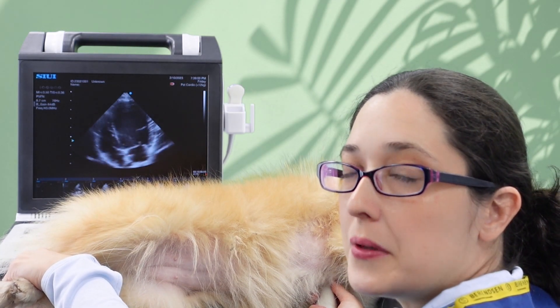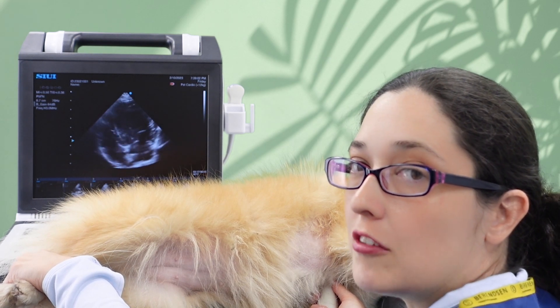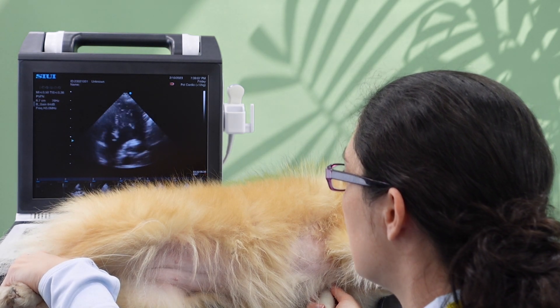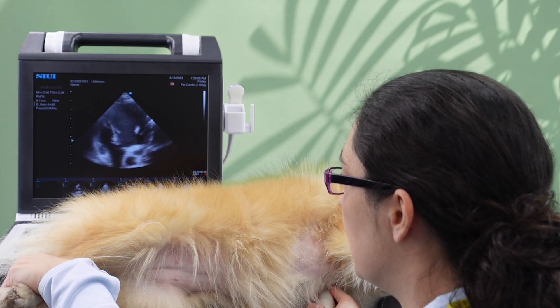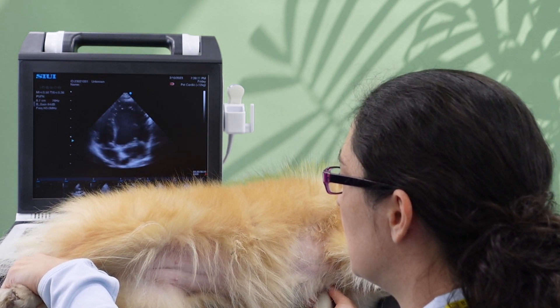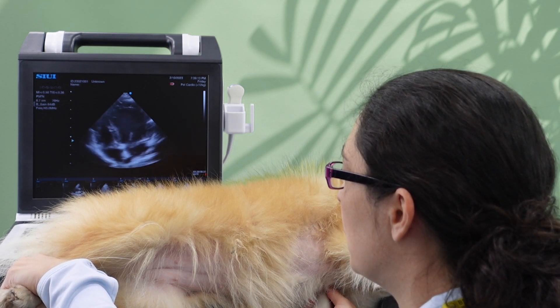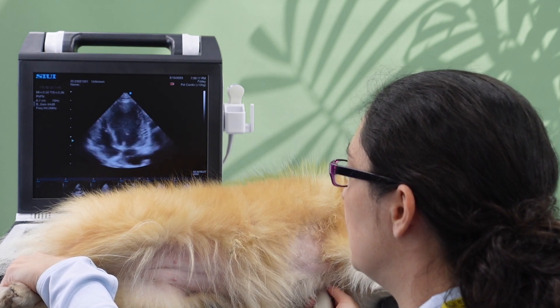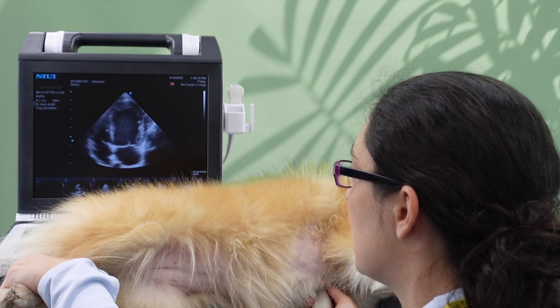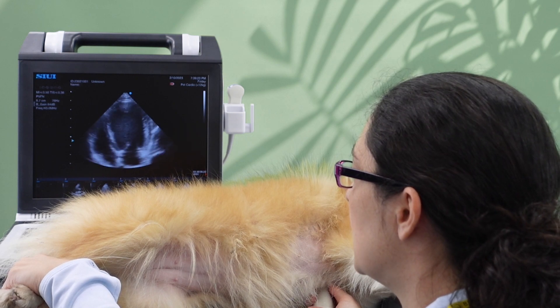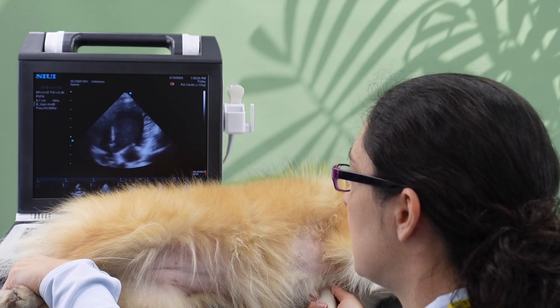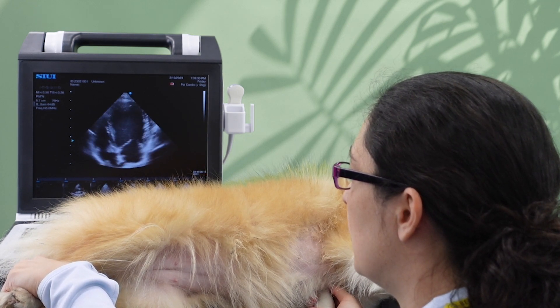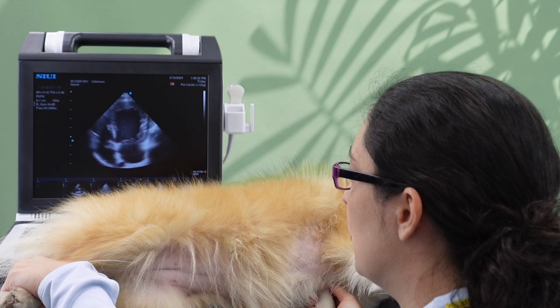One other common problem is to open up the aorta when you're supposed to be getting a four-chamber view. So if I tilt up towards her head, that's where I get my five-chamber view with the aorta. I want to make sure I've closed that off completely — I don't want that popping in to my four-chamber view when I don't want it there. So here is my four-chamber, opening up the aorta, five-chamber, tilting back again into a four-chamber.